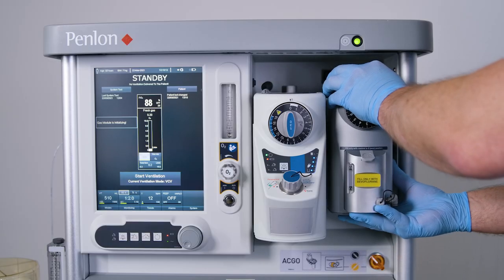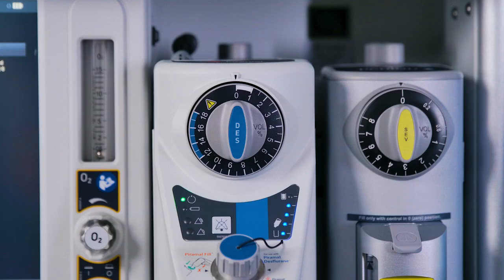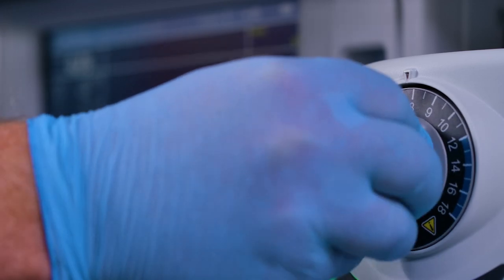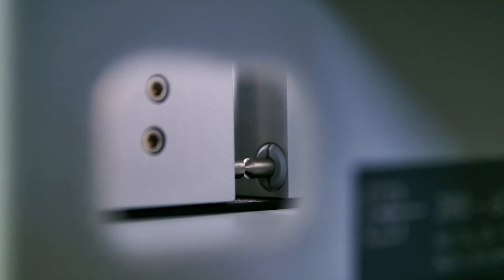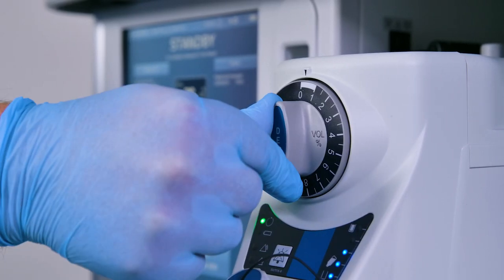Interlock system pre-use checks: mount another vaporizer on the machine back bar adjacent to the Sigma EVA. Allow the Sigma EVA vaporizer to finish warming up and enter standby mode, indicated by the power indicator being continuously illuminated. Push in the concentration control dial and rotate anti-clockwise. Check that the interlock bolt moves outwards so that only one vaporizer at a time can be turned on. Check that the interlock deactivates when the control dial is returned to the locked-out zero position.